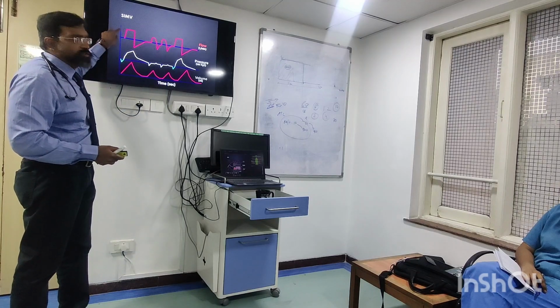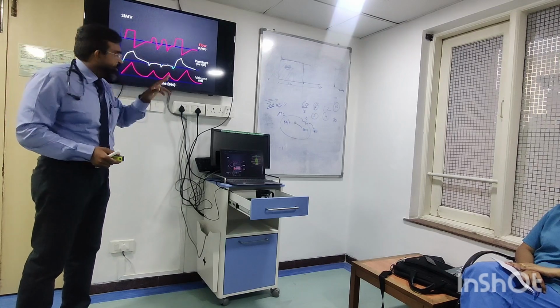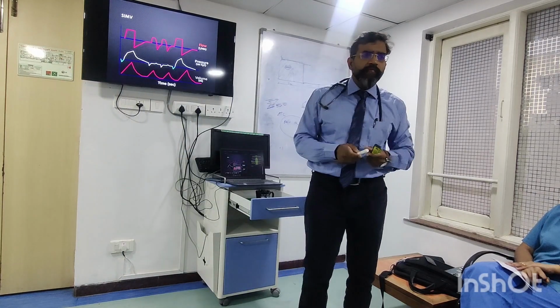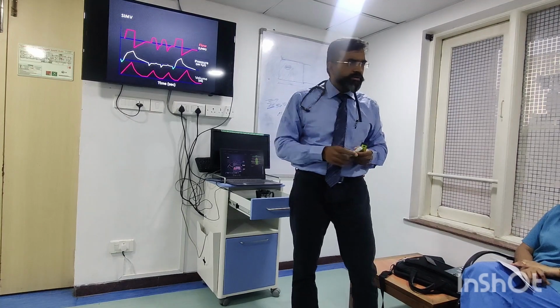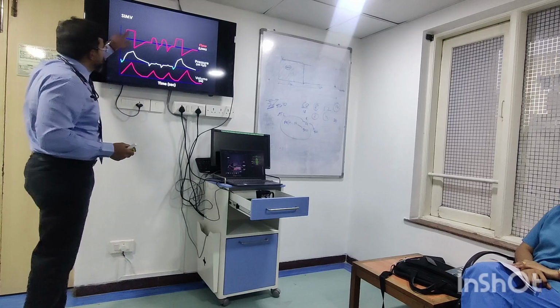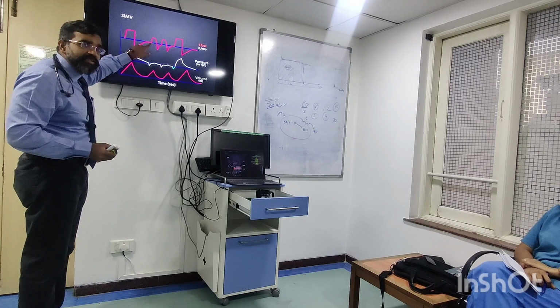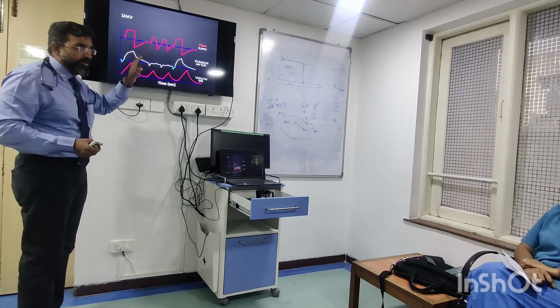This flow remains at whatever, say 60 liters, so 60 liters flow is going on. It delivers a constant flow, unlike variable pressures. Clear? More often than not, most of the ventilators, if you put volume control on your machine, you will see a constant flow wave pattern. Clear? In the flow wave pattern, we are seeing this to be constant flow because the ventilator is delivering the breath here. And then here you are seeing this variable because expiration is passive, the ventilator is not doing anything, it is the patient that is doing it, that's why it is varying.